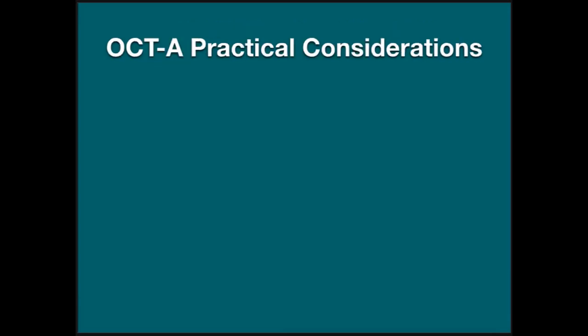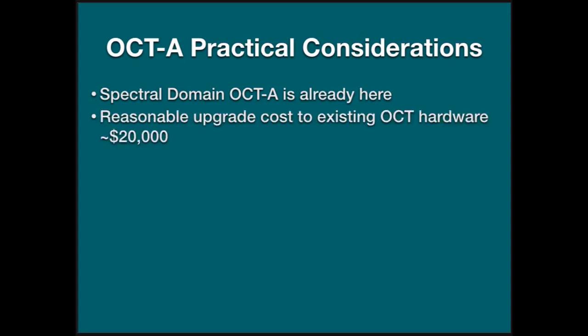All right, let's finish off with a little bit of summary about OCTA and some practical considerations. Spectral domain OCT is already here. I've already got it, lots of other practitioners have already got it, and it's being produced by a number of different companies. It's a fairly reasonable upgrade cost. Here in Australia, my NIDEK OCT unit with eye tracking and SLO and anterior segment capabilities is around the $80,000 mark, and it's around a $20,000 upgrade to bring in OCT angiography.